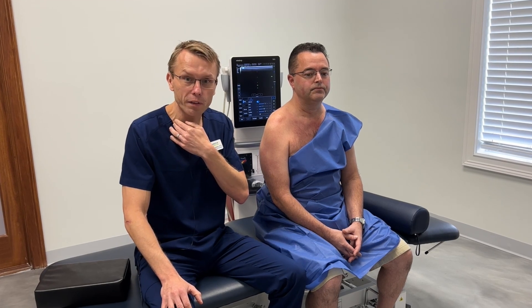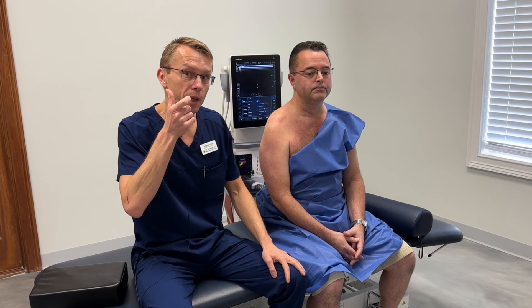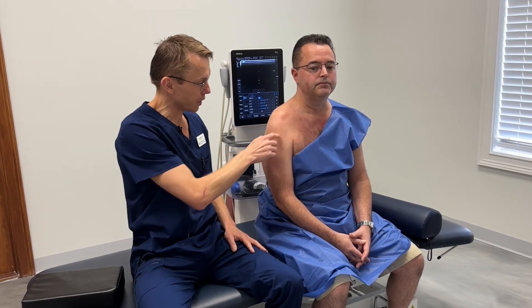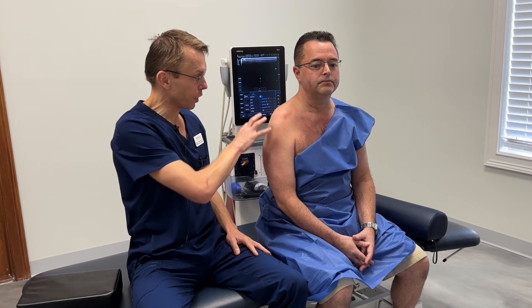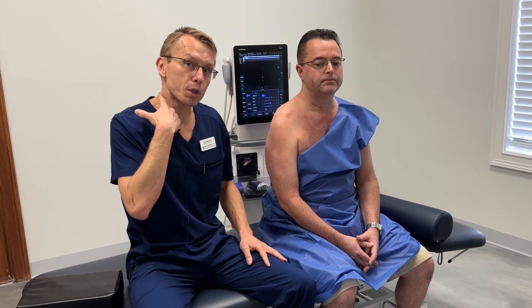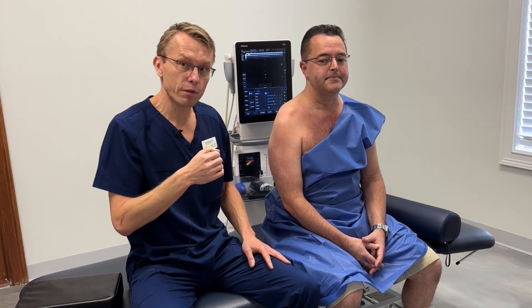Vincent had an unfortunate event seven weeks ago where he fell and injured his neck. He dislocated his neck. He had surgery, but he developed weakness and atrophy of his muscles. You can see the deltoid right here is atrophied. I did an EMG on him and it showed significant nerve damage to this area. So what we're going to do is treat the nerves at the neck and the brachial plexus and see if we can get some of that function back.